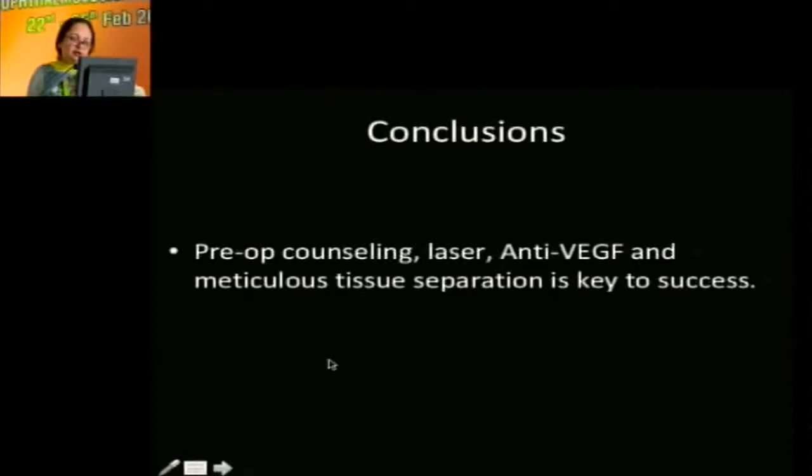So to conclude, for combined detachments, preoperative counseling, a good laser, anti-VEGF, and meticulous tissue separation is the key to success. Thank you very much.